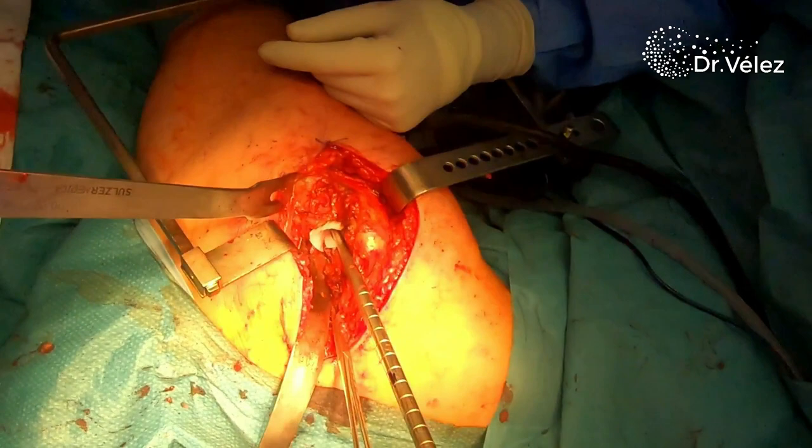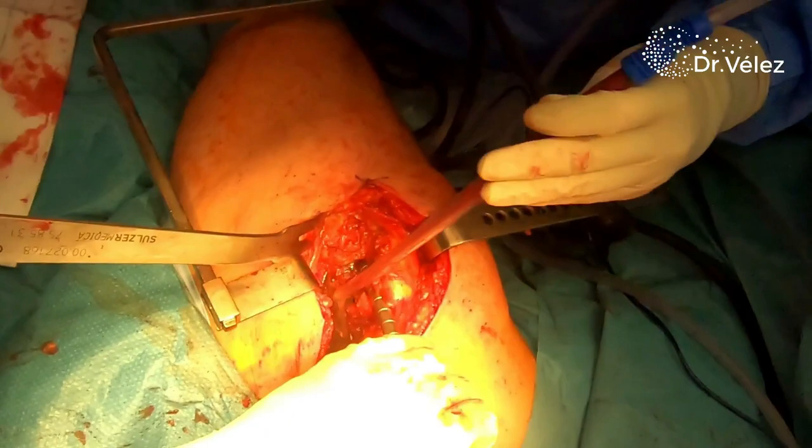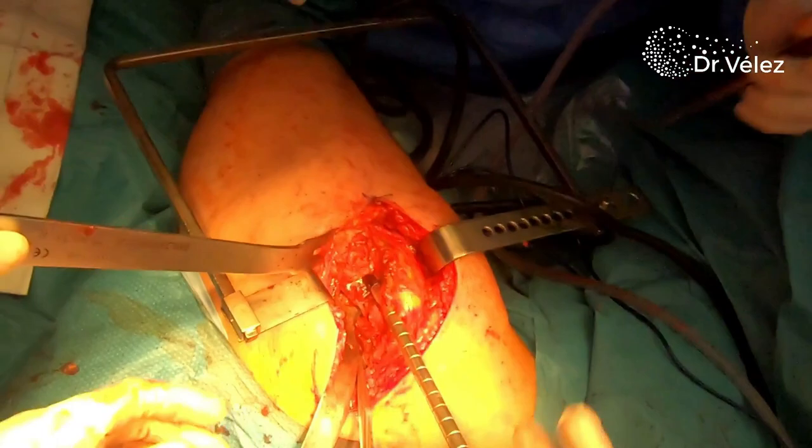After this, we normally use a pulse lavage gun, and we clean out the femoral canal with around 3 liters of saline.